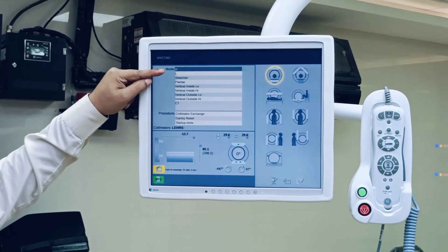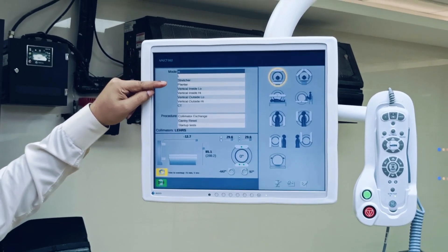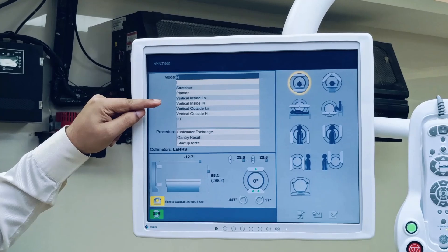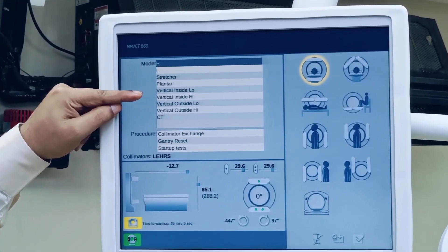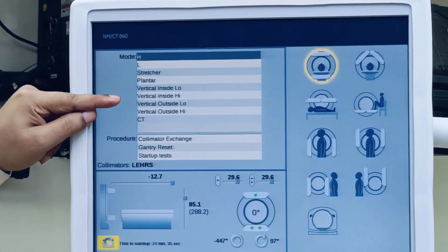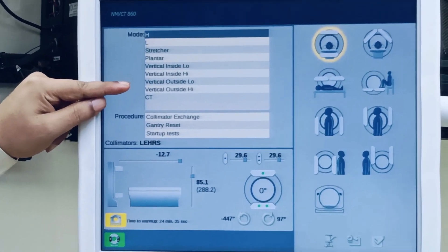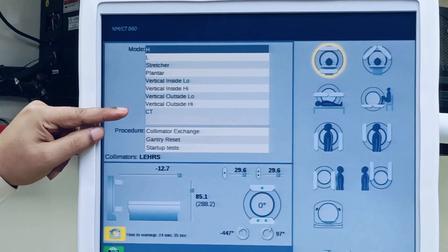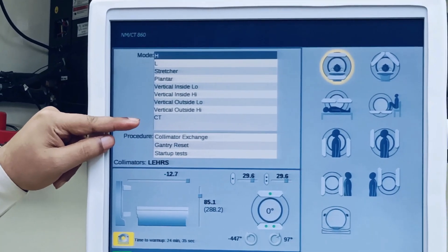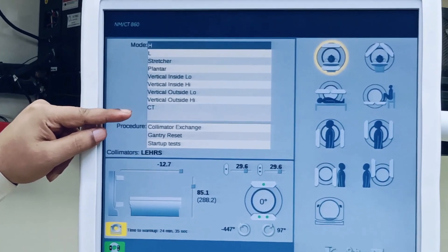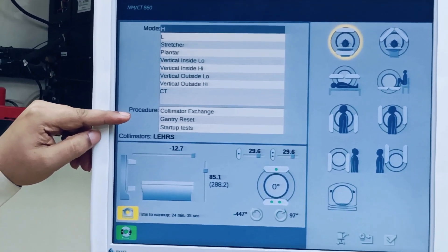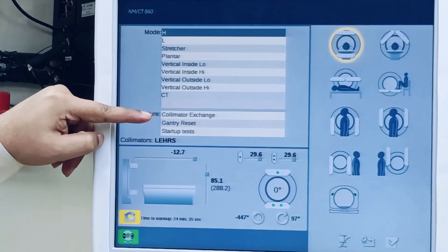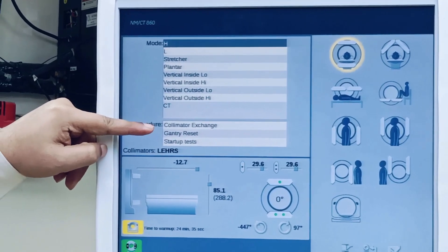The modes available are: H mode, L mode, stretcher mode, plantar mode, vertical inside low, vertical inside high, vertical outside low, vertical outside high, and CT mode. If you want to change the collimator, there is an option for that as well.